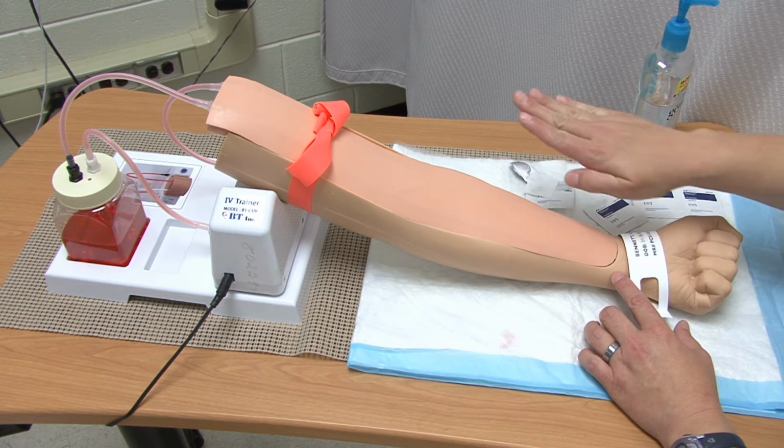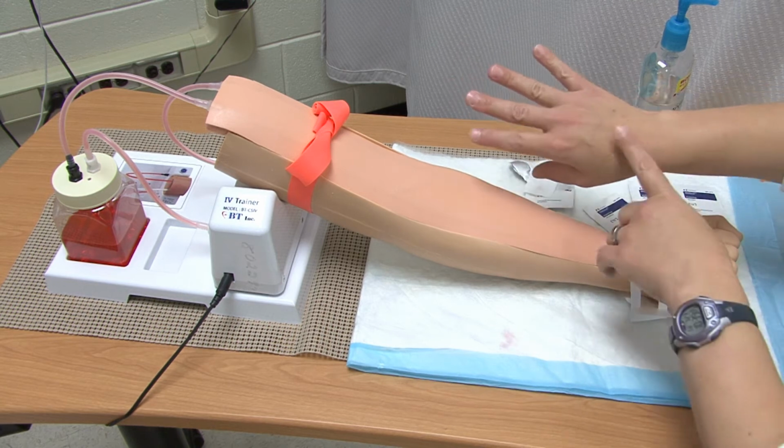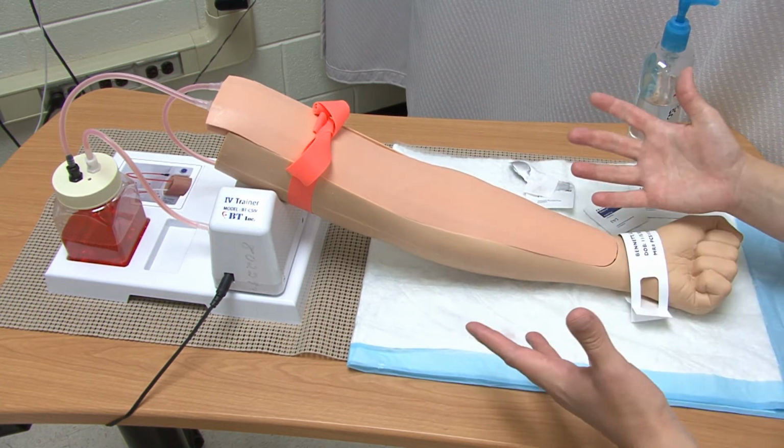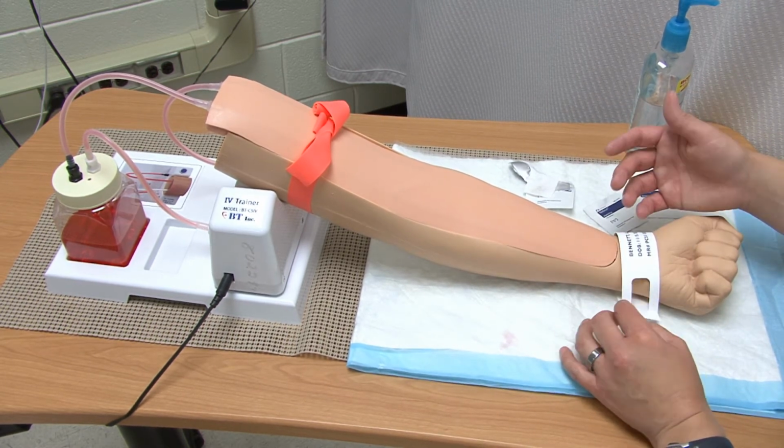Anytime you're looking, you always want to start from the patient's hand and work your way up. Lots of people don't like the IVs in the hands, and you also have to remember that it might require a smaller gauge. But it depends, like I said, on the purpose and your patient's wishes.